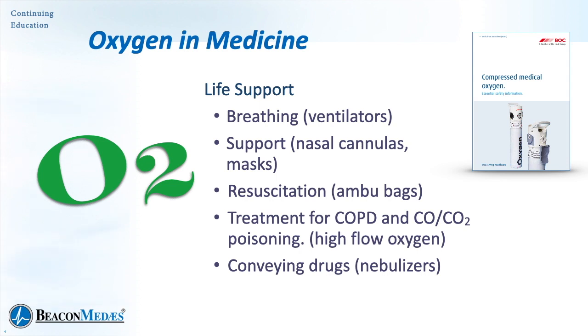Of course, we traditionally have used it for treatment for chronic obstructive pulmonary disease, carbon monoxide and carbon dioxide poisoning. We would use oxygen at high flows for those purposes. And we would use nebulizers, turn the drugs into a mist, if you will, and then breathe those in. So oxygen was used as a way to convey drugs.